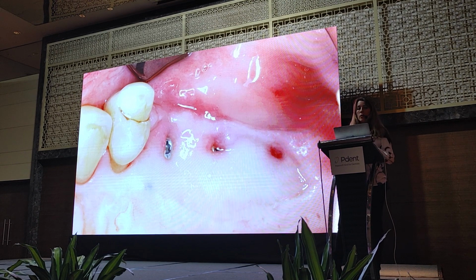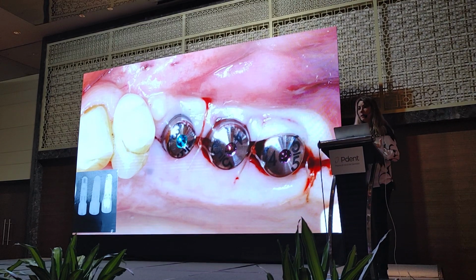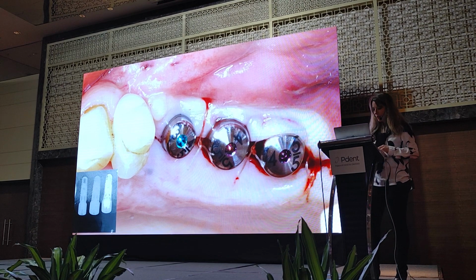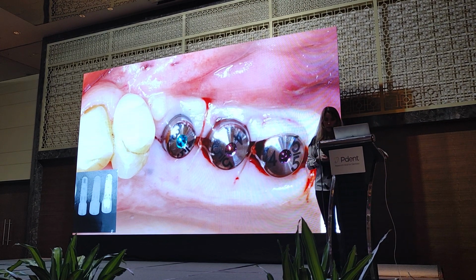So these are the cover screws on the implants, so I could do the covering. The implants were also well integrated, and we had the X-ray that was okay. So I gave the green light to do the prosthetics.